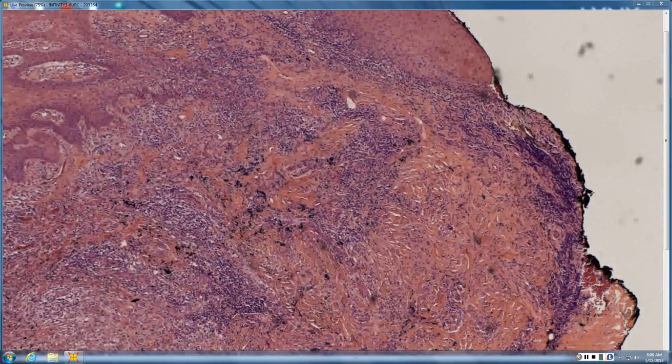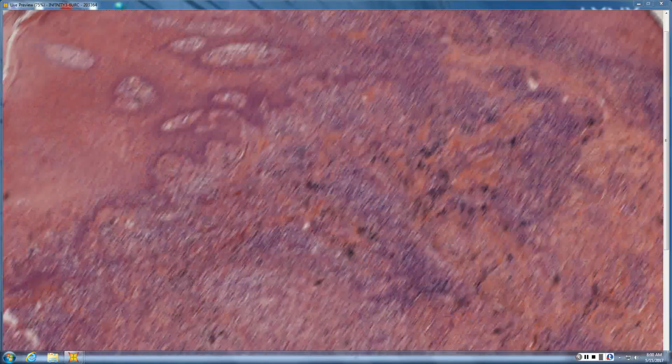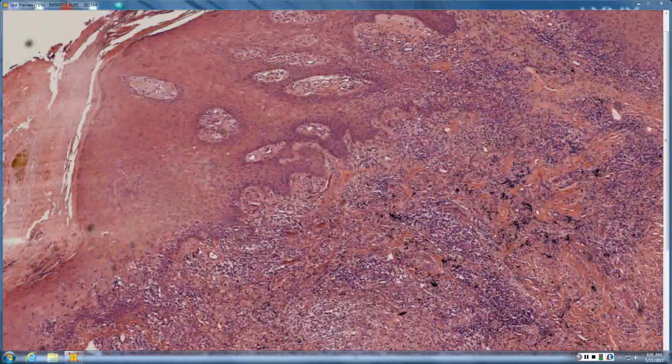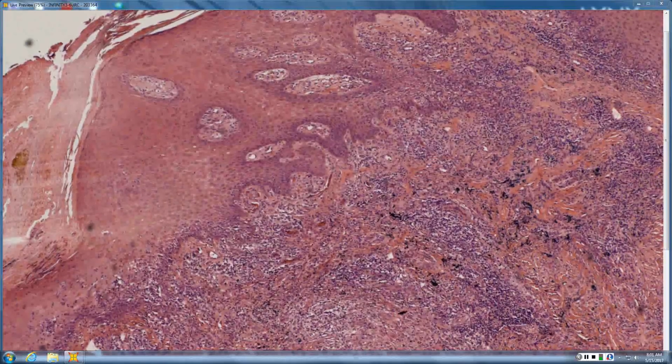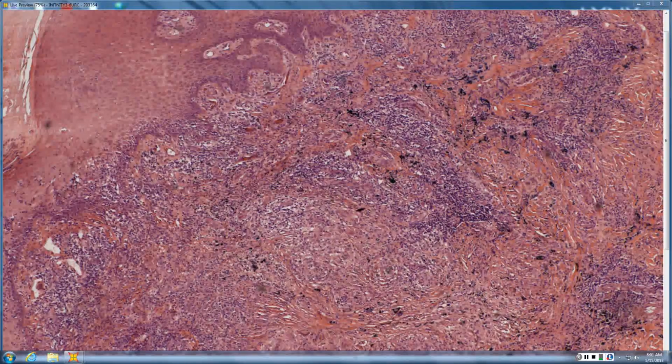So it looks like you have some exogenous pigment or a tattoo. It looks kind of bluish, and then you have lots of granuloma. So tattoo reaction. There's pseudoepitheliomatous hyperplasia, PEH, with pus. You probably want to stain it for atypical mycobacteria. Get an auramine rhodamine, because tattoo pigments are aqueous and often will grow atypical mycobacteria, and there have been outbreaks where you have 1,000 people in a city with mycobacterial granulomas because of one bottle of tattoo ink. But many of them are allergic as well. Blues, but especially reds, are famous for that.